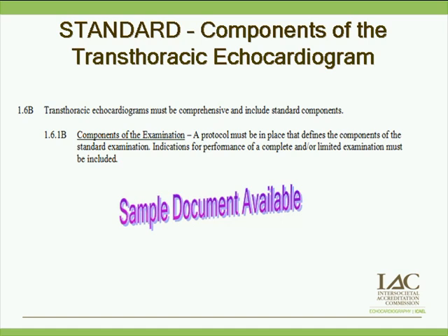Transthoracic echoes have to be comprehensive and include the standard components, and a protocol must be in place that defines these components, and indications for performance of a complete or limited examination must be included. And there is a nice sample document available if you need help or to get an idea of what a protocol should look like. Or you can use that one and just adapt it to how your studies are done in your laboratory. But make sure it's your laboratory-specific protocol, not one that you've gotten off our website or from the lab down the street, and it's not at all how you do your studies.